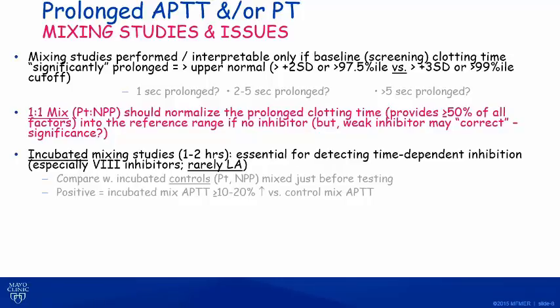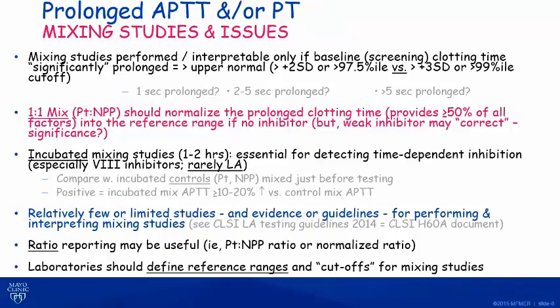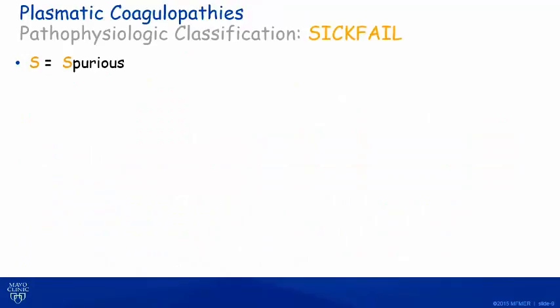Incubated studies are primarily done to detect time-dependent inhibitors such as a factor VIII inhibitor. There are limited evidence and studies. The best guidelines for interpreting and performing mixing studies are in the Clinical Laboratory Standards Institute Lupus Anticoagulant Test Guidelines.